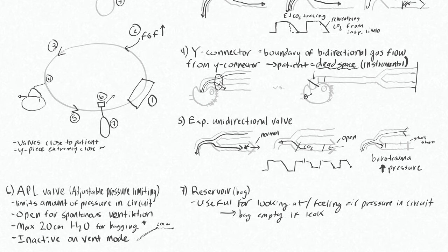It's going to be extremely close to patient. The fresh gas flow is going to be after the CO2 absorber and close to the inspiratory limb. That makes sense, because you want your fresh gas, or the new gas that's coming through, to be what gets to the patient first. And you also want to try to minimize the gas flow through the CO2 absorber wherever possible. So it's better if you just send all this new gas flow directly through closer to the unidirectional inspiratory valve than anything.